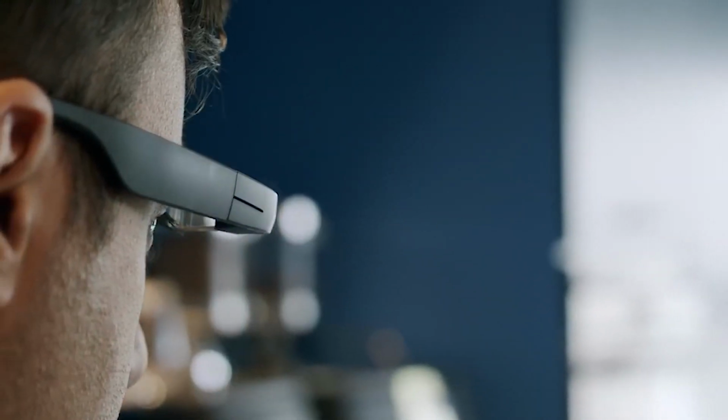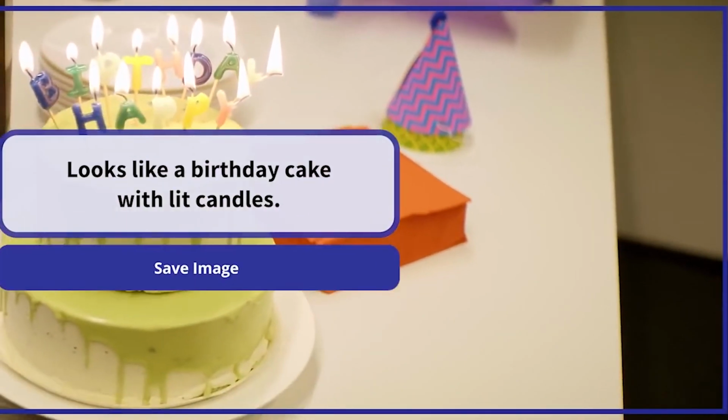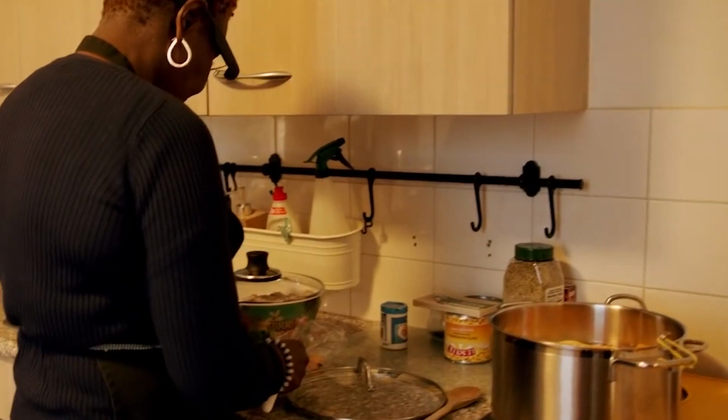The second thing is recognizing faces. So we had to figure out a way to allow users to teach faces of their friends or family members to the glasses. So once you teach the glasses that, okay, this is Joel, anytime you're in the frame, it can speak your name. We're also working on a feature where it can tell you how far you are and so on. So recognizing faces is one thing. Recognizing objects is another aspect of it, because there are so many objects in everyday life that visually impaired people use. So we worked a lot on improving the object recognition capability of it. And so that is another aspect.